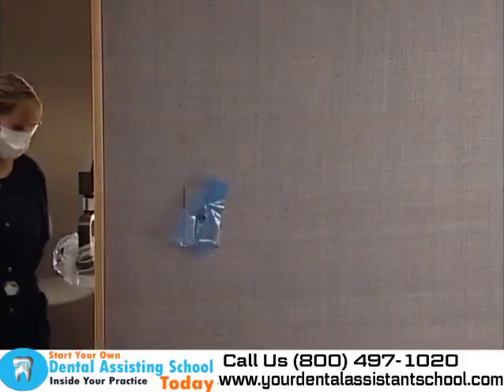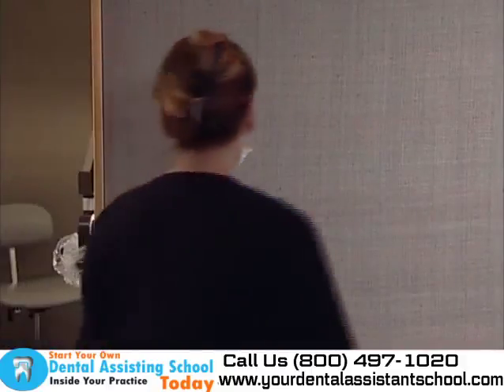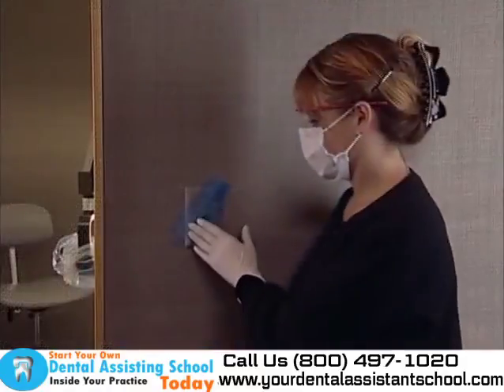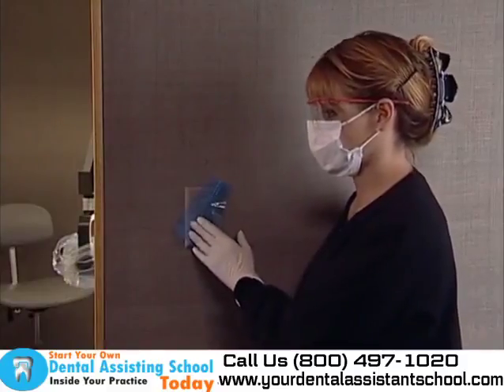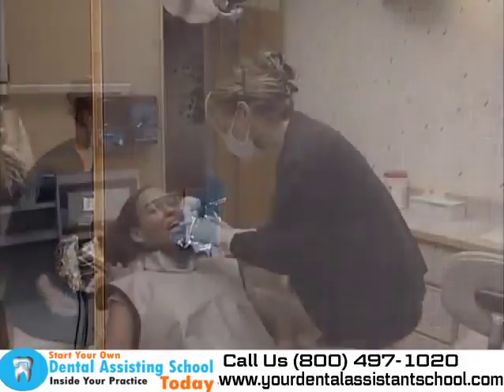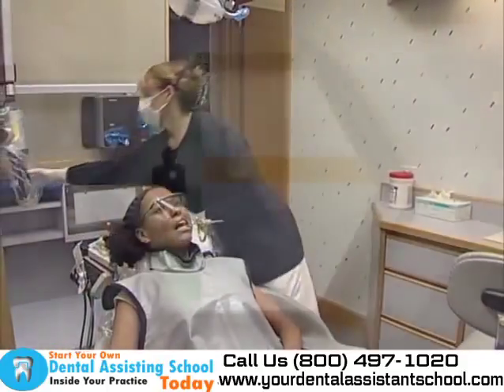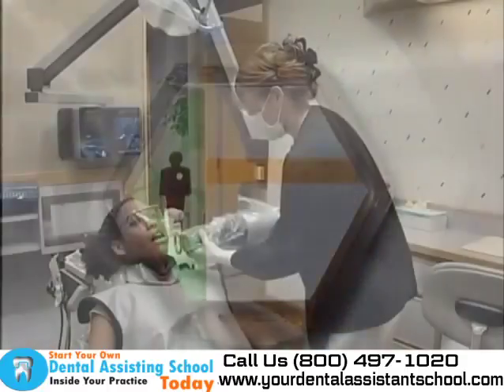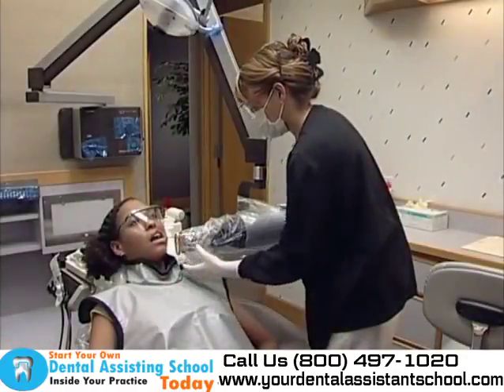A standard in all dental offices is the placement of the exposure button outside of the room where the X-ray machine is located. This helps protect the dental assistant from the potentially harmful effects of repeated radiation exposure. Many offices use X-ray monitoring devices to ensure the dental assistant is not receiving scatter radiation.